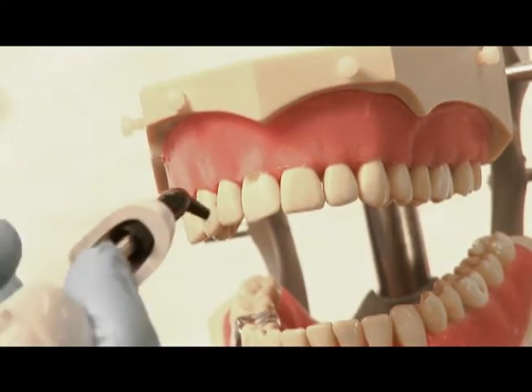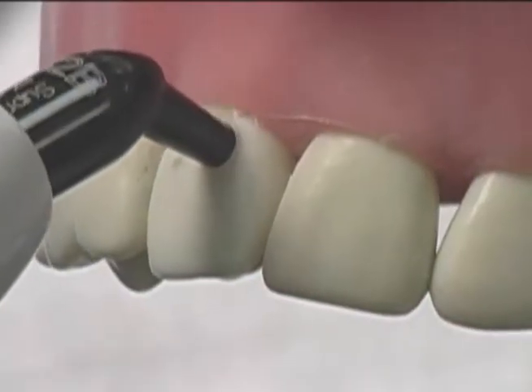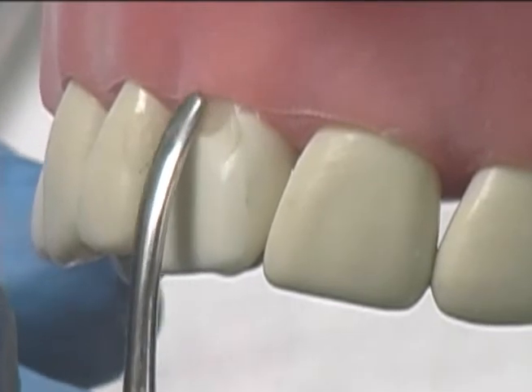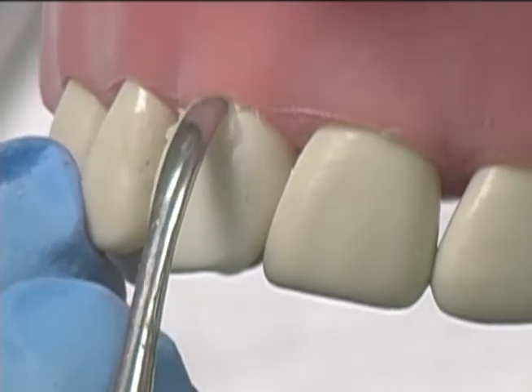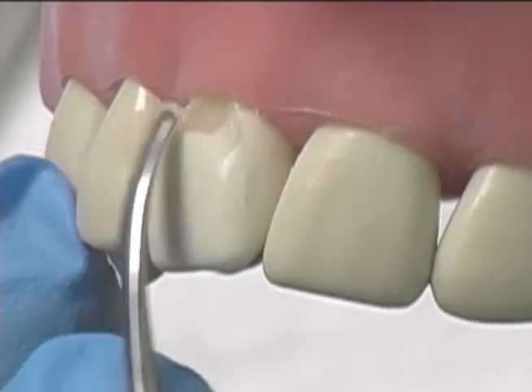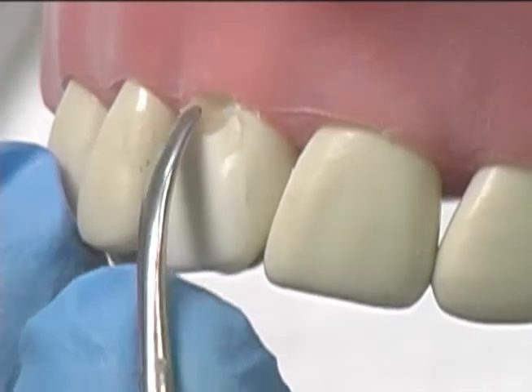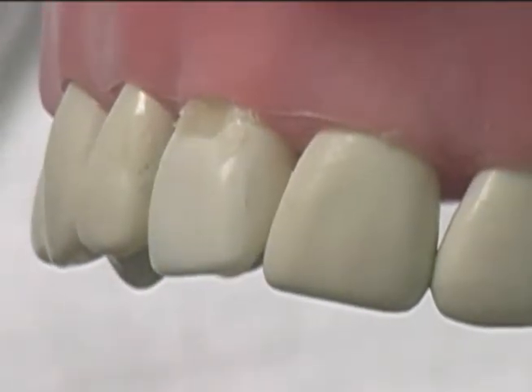I'll often use a second or third layer again, keeping mostly in contact with the incisal portion of the preparation and avoiding a full contact with the dentin at the cervical until the final layer is placed. This will avoid contraction shrinkage, where we've often seen at the cervical a brown line of composite where the composite shrinkage has produced an immediate gap. Curing the second layer.